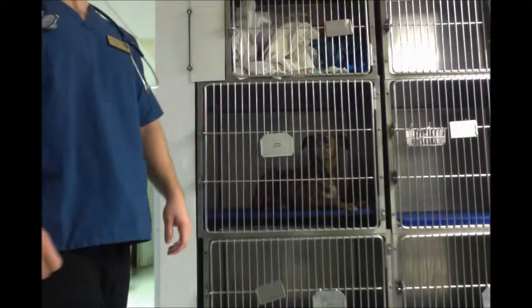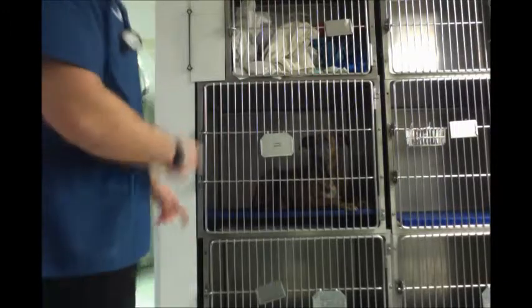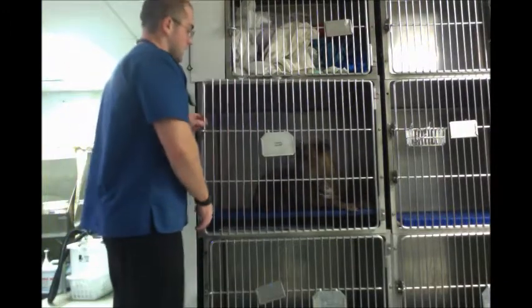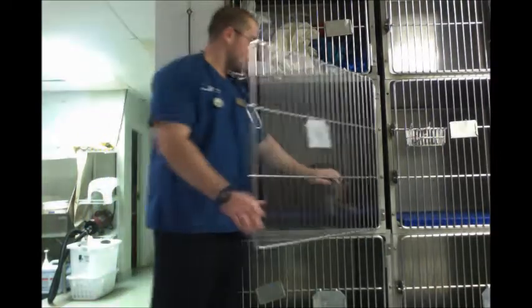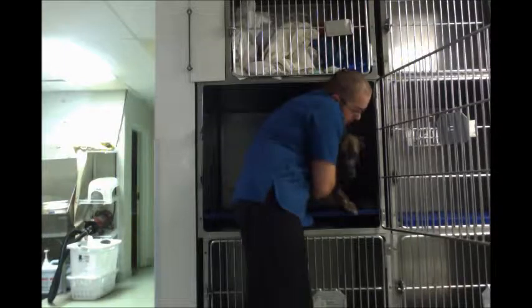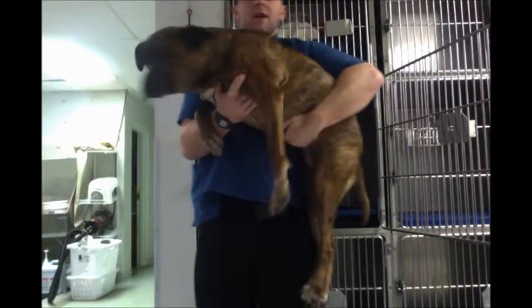Okay, next we're going to properly get an animal out of a cage. So I've got Lacey in a cage here, top one. So what you're going to do is make sure that she doesn't jump out here, first of all. And then make sure that you have a nice firm grip on that back end. And you just pull her right out, just like that.